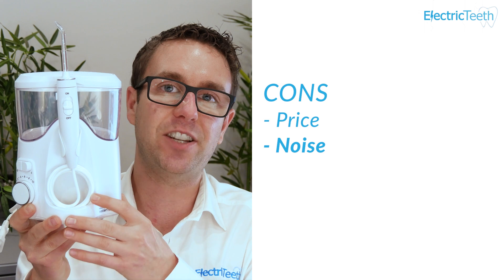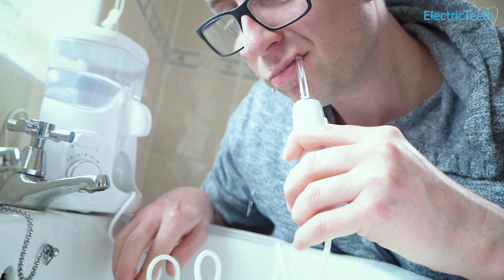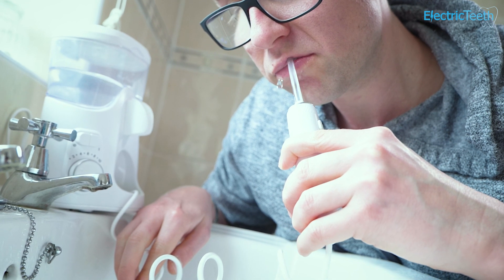Another con has to be the noise. By the very nature of this product it is quite noisy in operation, at around 77 decibels — the pump makes noise as it pushes the water through. The more premium Ultra Professional is a little bit quieter. Just bear this in mind if you're deciding to use this at times when others in the house may be asleep.